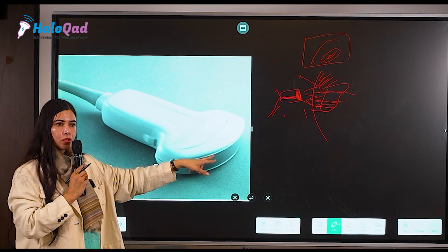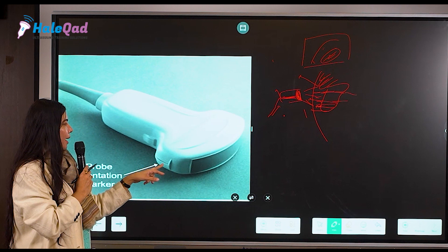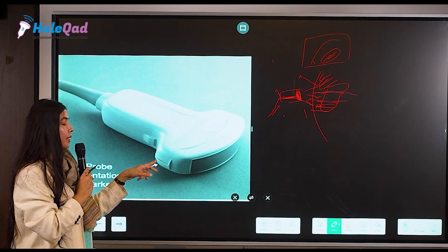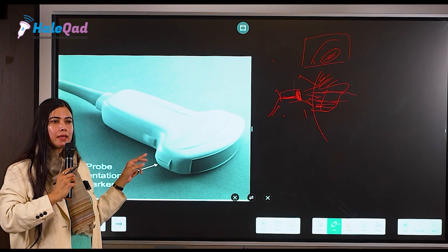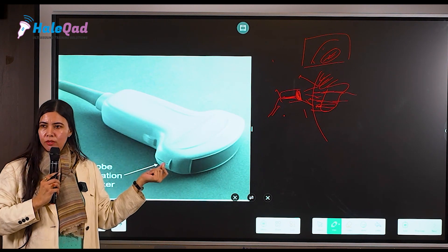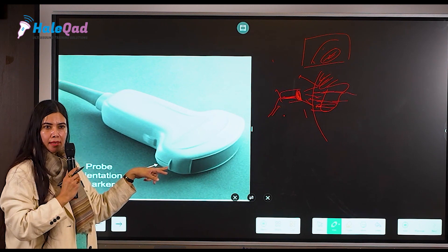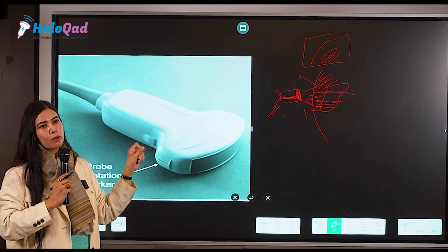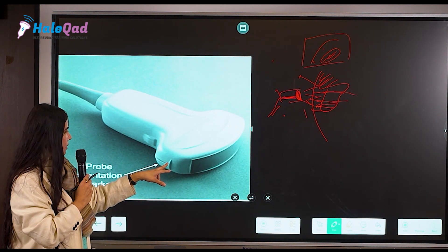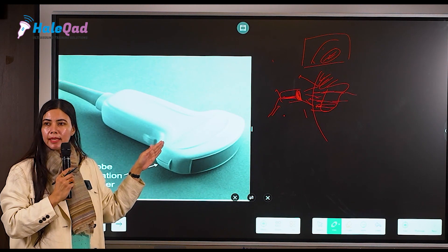The probe costs as much as the machine itself, and it is this gray area — if you keep it safe, your probe is safe. You can see a marker on the probe; it can be a depression, a black or white indicator, or an elevated area. There is always a marker on the probe, and this probe marker is very important because by it we decide the direction of the probe.